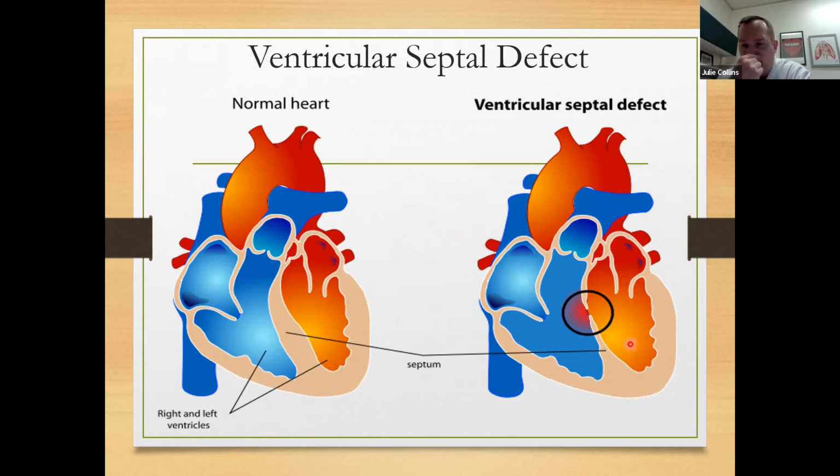And what's the whole point of the LV vent? Is it to unload the left ventricle? Right, correct. So why we don't want the left ventricle to get distended during the case, especially when you have a heart that's already decompressed and arrested in diastole. You can definitely do damage to the myocytes by overstretching it.